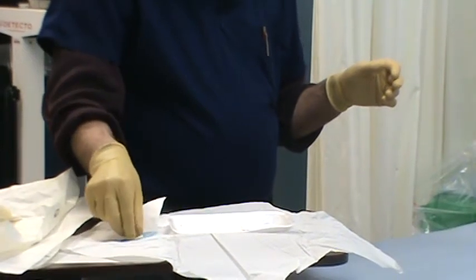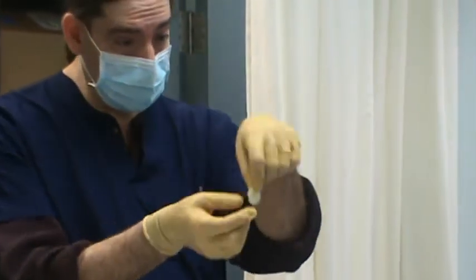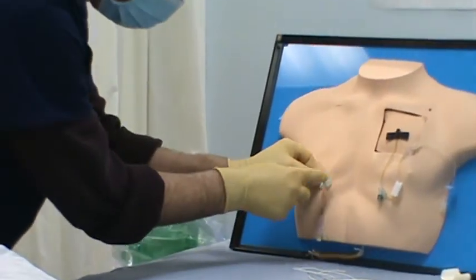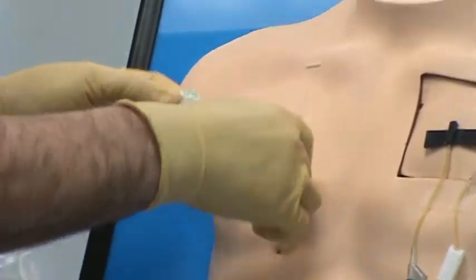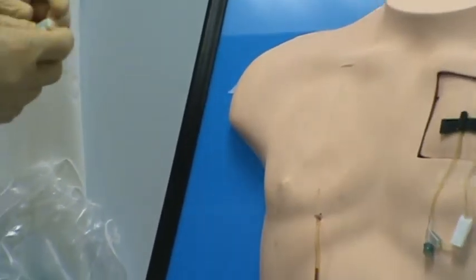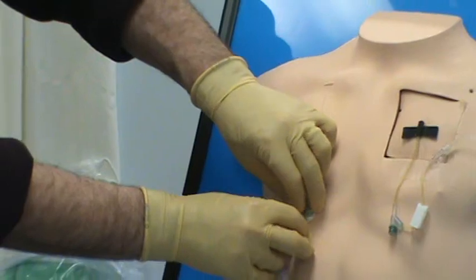Now I got this little antibiotic pad or disc. Now notice the disc has a little opening, a little like a C. I don't want to put it up like that other one was. I want to put it so that it will fall right off when I go to take the tape off. So I'm going to put my little disc on, and it will be down like that. Now, sometimes the line might want to go up. It just depends on the type of line. Then it would be up like that. Just depends on how your line goes. This line happens to be going down, so I'm going to stick it on going down. Okay.